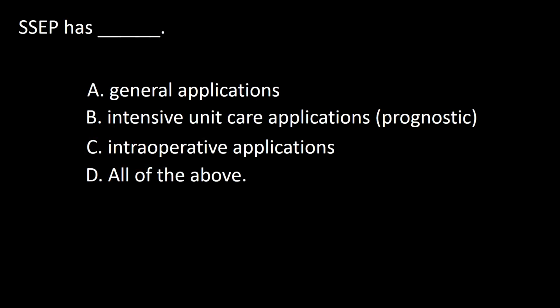First question. Somatosensory evoked potential has: A. General applications. B. Intensive care unit applications. C. Intraoperative applications. D. All of the above.